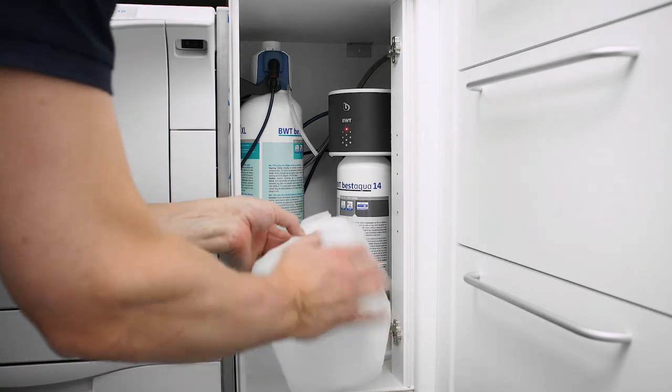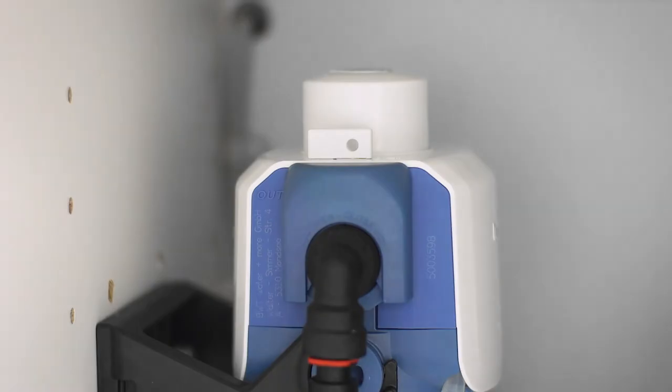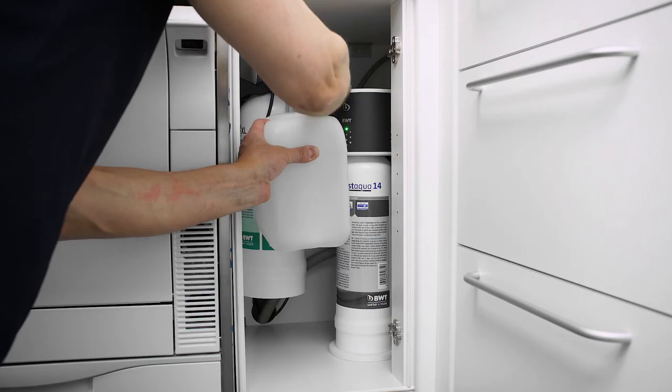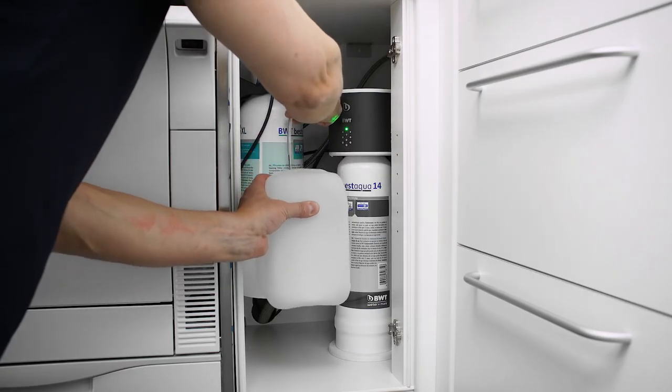Next, you need to vent the Best Ammon filter. Open the small flush valve which you will find on top of the white filter head. Be sure to have a small canister or bucket ready.